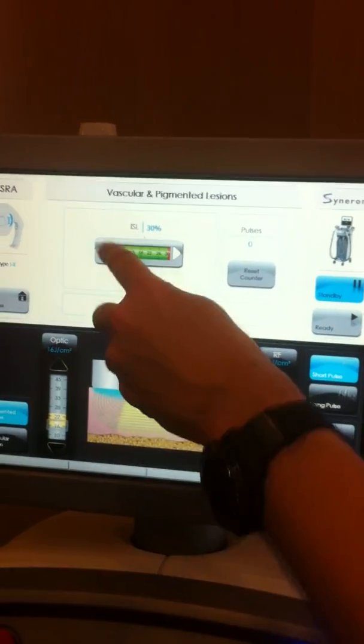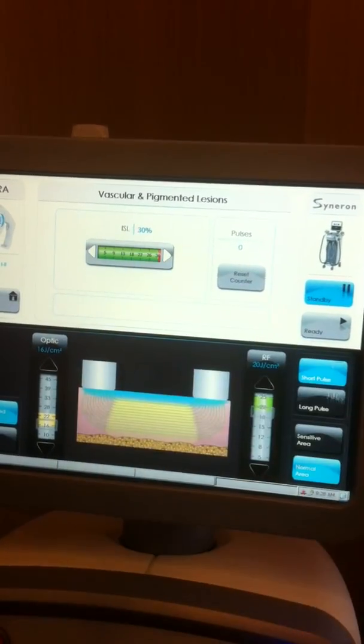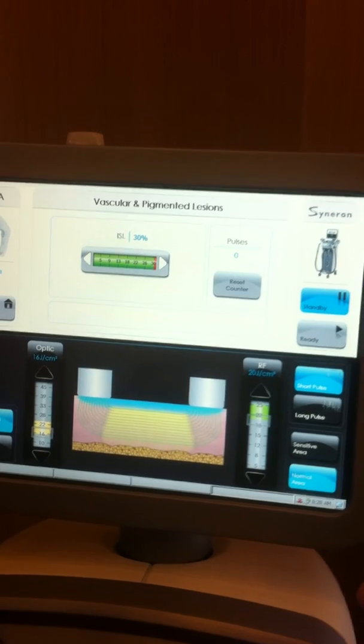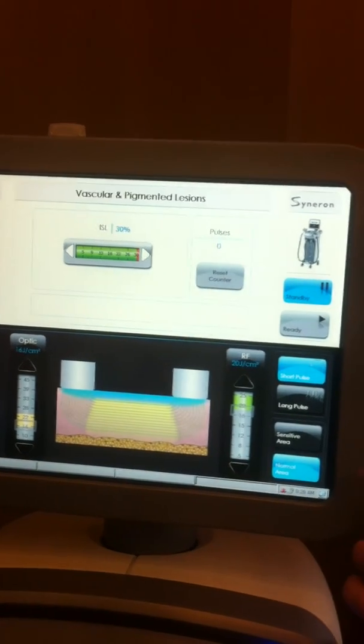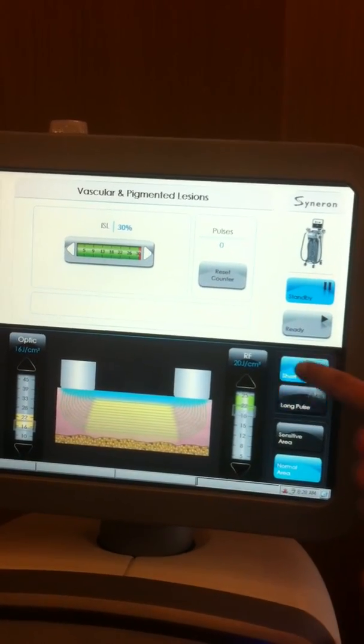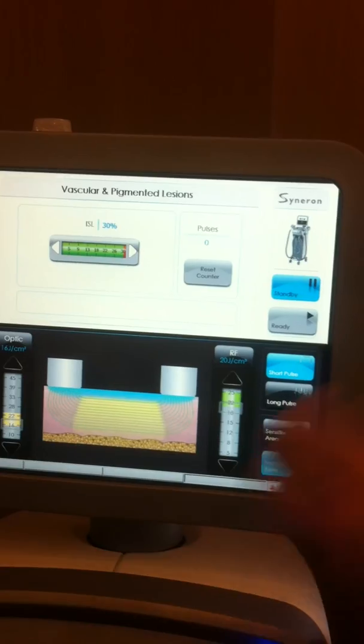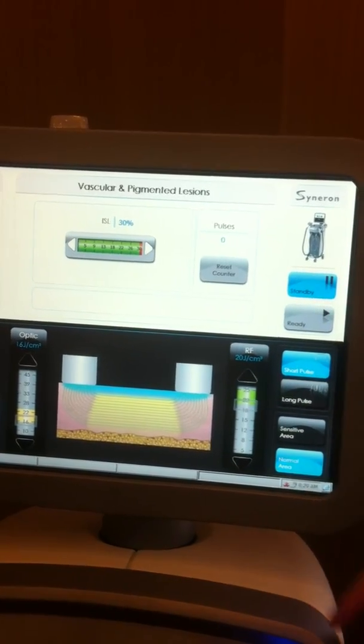Again, I see my skin type here, my ISL, my RF, my optical. And just all the normal things. Short, long pulse. Basically, all the things that you used to have.